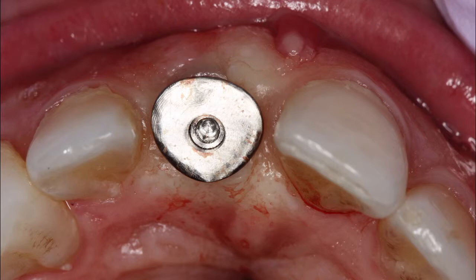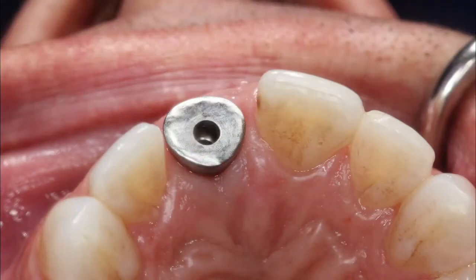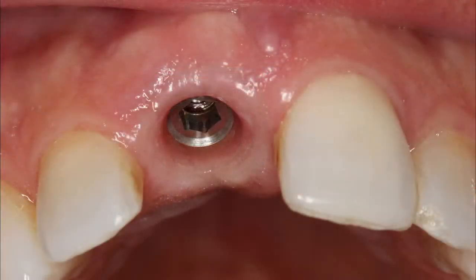in order to train the soft tissue to mimic the original root shape of the tooth. The patient wore a partial removable appliance until the final impression appointment. In Figure 17, following 4 months of healing, the patient returned to the office for the final impression, exhibiting excellent tissue health surrounding the custom healing abutment.